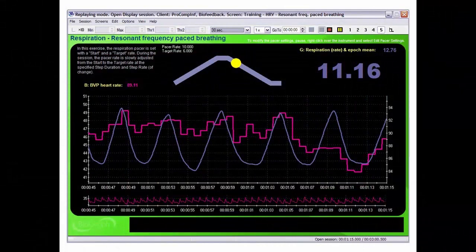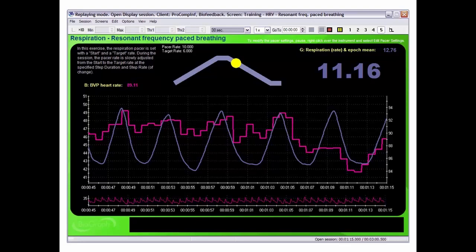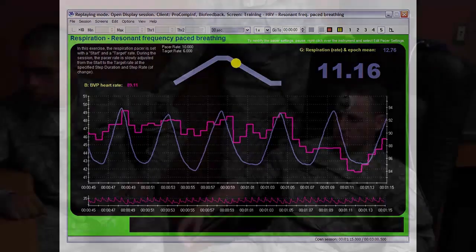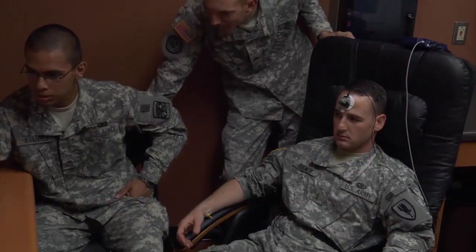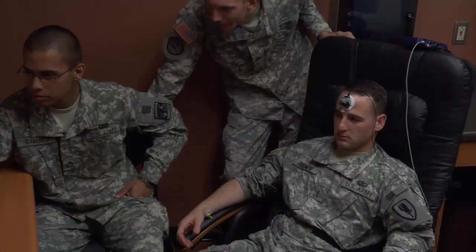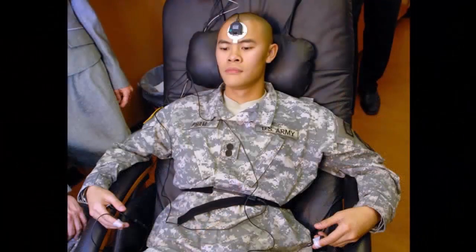The goal is to synchronize respiratory and heart rate oscillations and maximize the amplitude of the heart rate variability waves. In order to achieve this goal and determine resonant frequency, the cadet is instructed to follow the pacer bar stimulus as it moves up and down the peak.